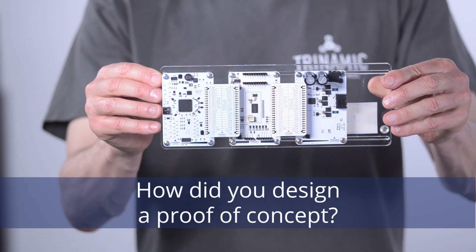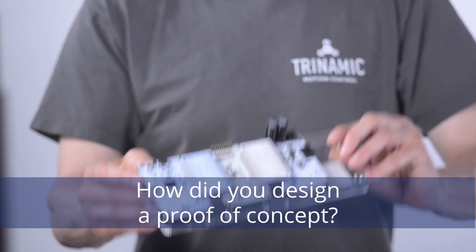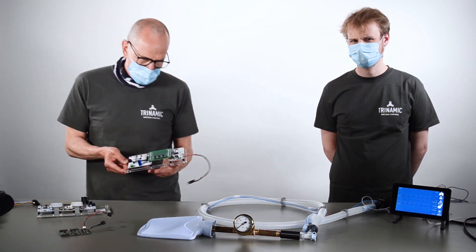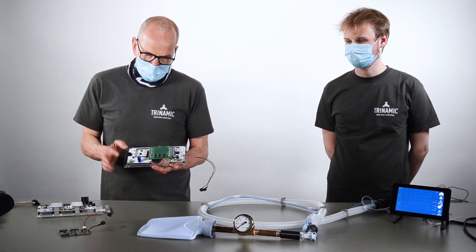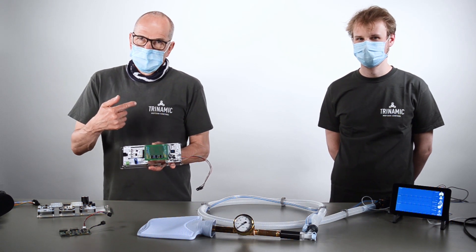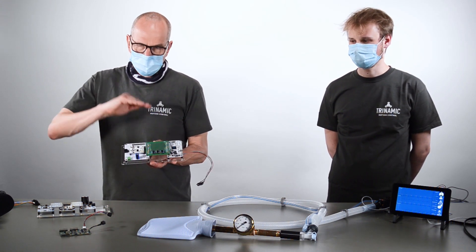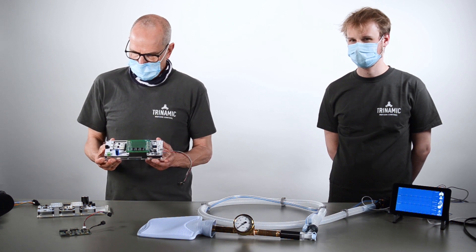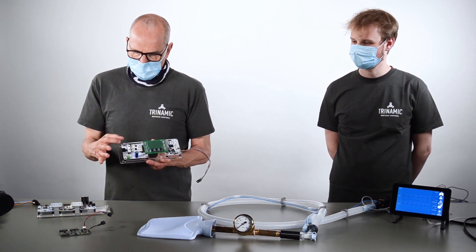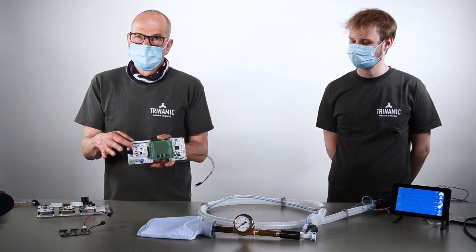The steps we started with were, of course, our evaluation kit. As a next step, we integrated pressure sensors to be able to close the loop concerning pressure and to do very precise ramping with the pressure.